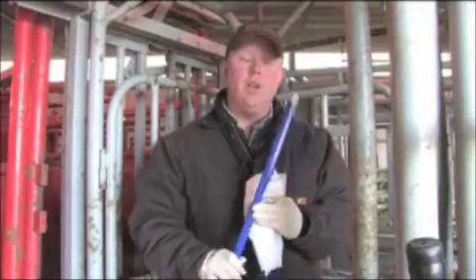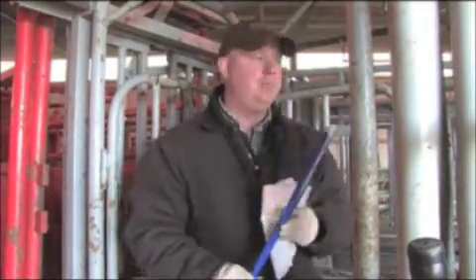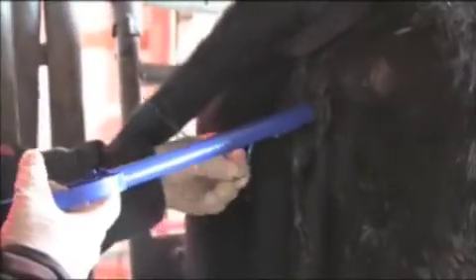for the predetermined time that you want for the synchronization protocol. Now that we have the CIDR loaded into the CIDR applicator, we'll demonstrate how to properly insert the CIDR into the cow. To insert the CIDR, approach the cow with caution, clean her vulva with paper towels to avoid dragging any fecal contamination into the vagina. Once the vulva is cleaned, spread the vulva lips with one hand and insert the CIDR and applicator at an upward angle, ensuring that the tail of the CIDR is pointed down.